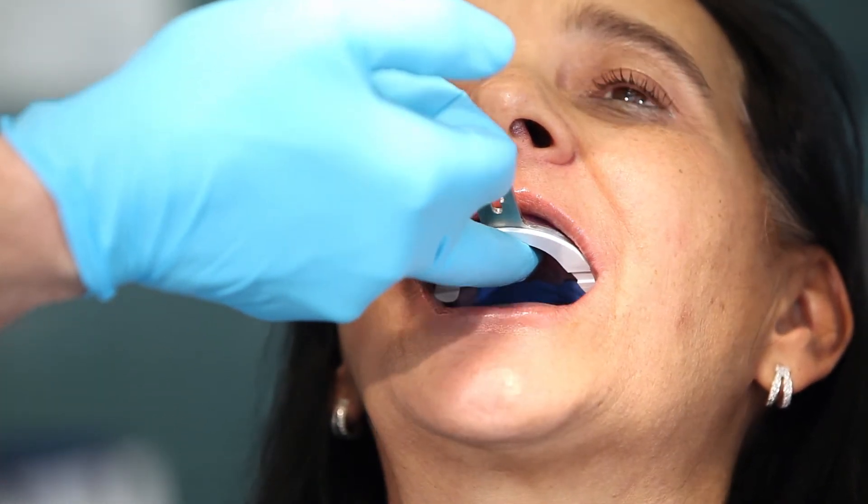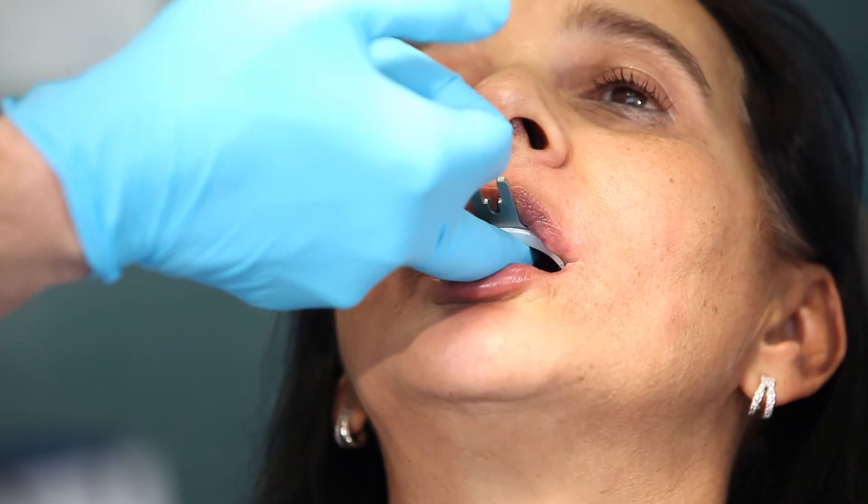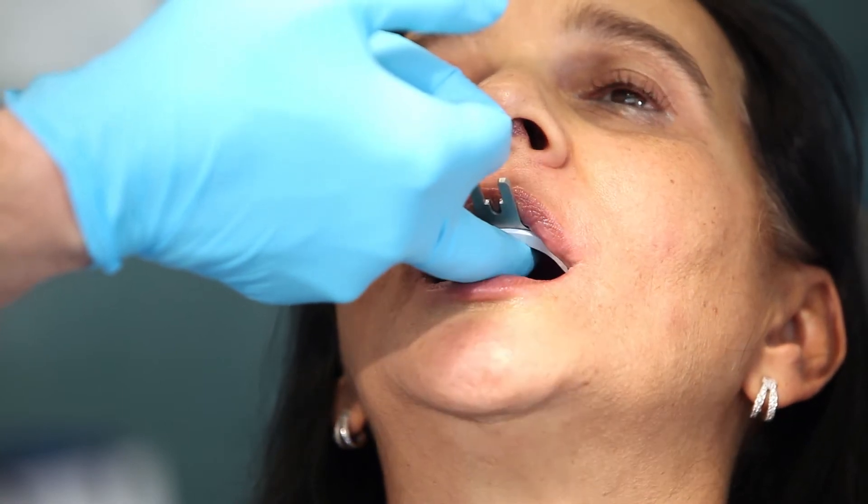Ask the patient to suck on your finger once or twice and to move the lower jaw to the right and to the left. This activates the muscles.